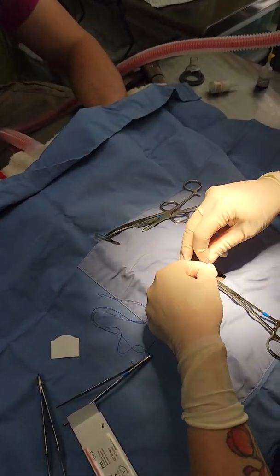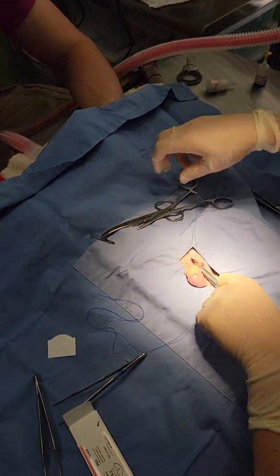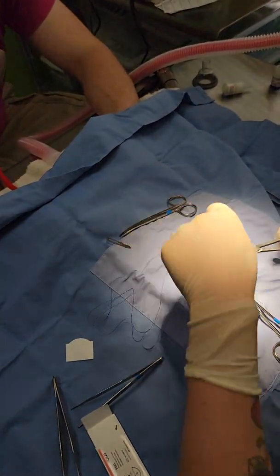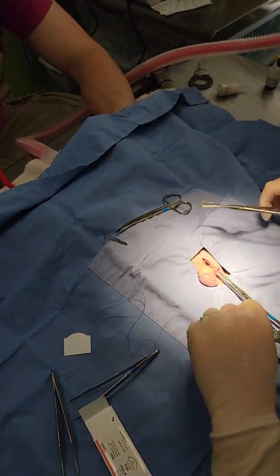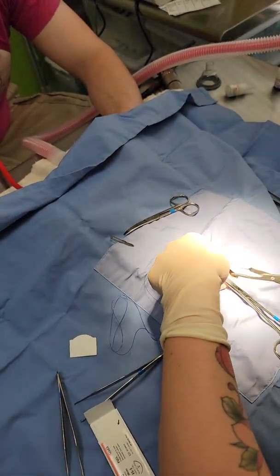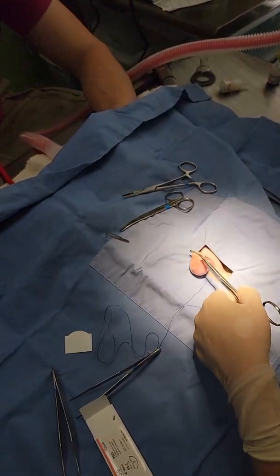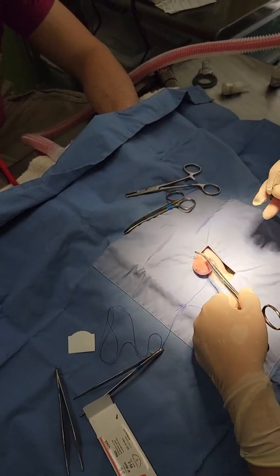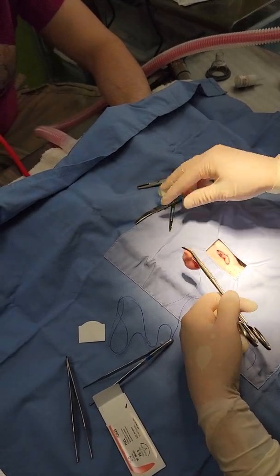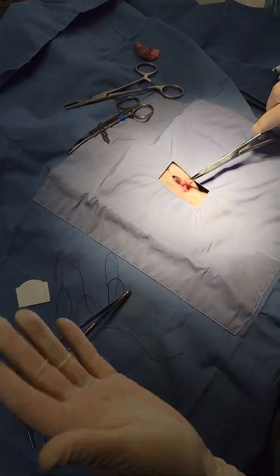And this is two. So in some cases I will use a transfixation ligature, not all the time. I feel like their pedicle is not typically as risky for ligature slippage, but I personally have always liked transfixation ligatures. Now that I've made my two ligatures here and here, I'm going to cut here. I'm going to put my testicle over there. Always just make sure it's not bleeding — it normally does not.